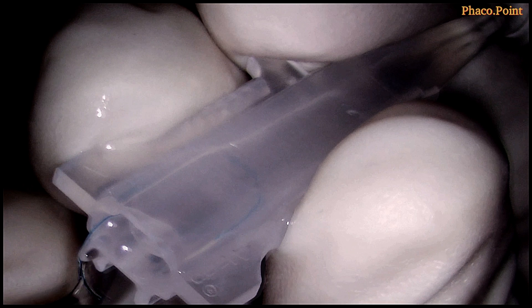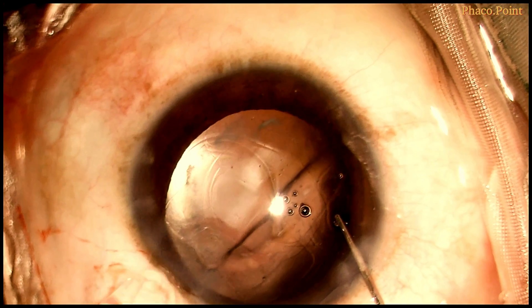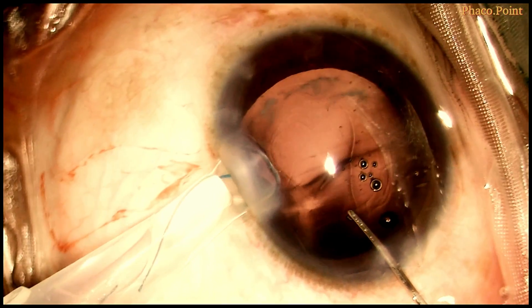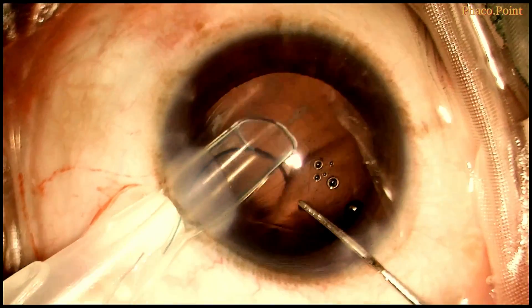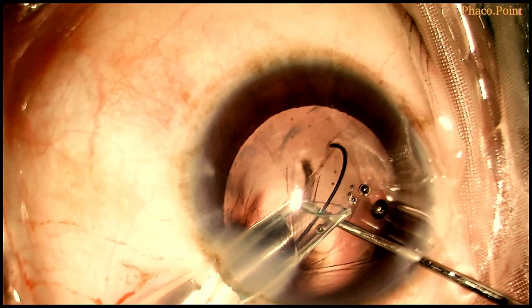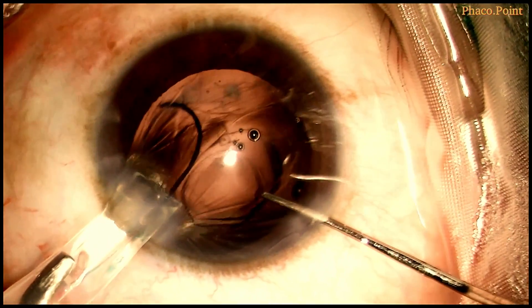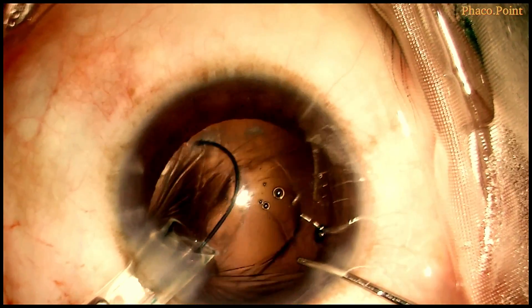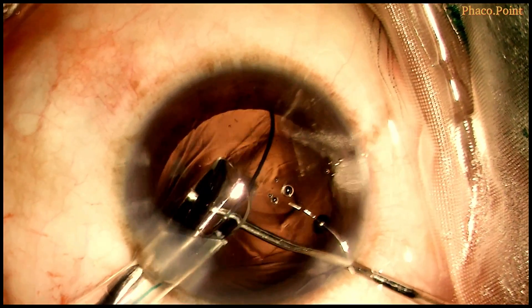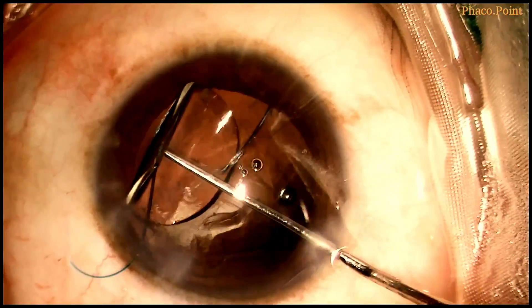We must always have adequate viscoelastic in the anterior chamber as well as a second instrument to support the IOL. In this case, note how the trailing haptic seems to be going in a downward direction — one needs to withdraw a little bit and turn the nozzle to acquire the correct orientation of the leading haptic to ensure it goes into the ciliary sulcus.